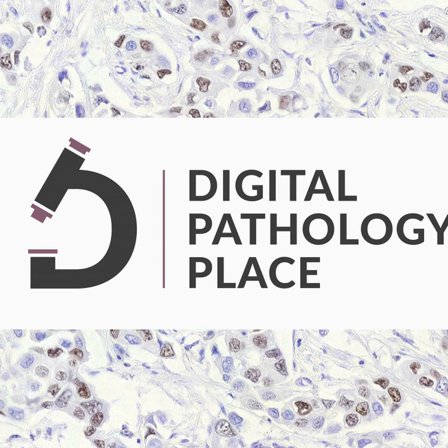Through digital pathology, high-resolution images of the tissue under examination can be swiftly transferred to a remote pathologist for instant analysis. This not only facilitates immediate feedback to the surgical team, but it also allows access to subspecialty expertise irrespective of geographic boundaries.